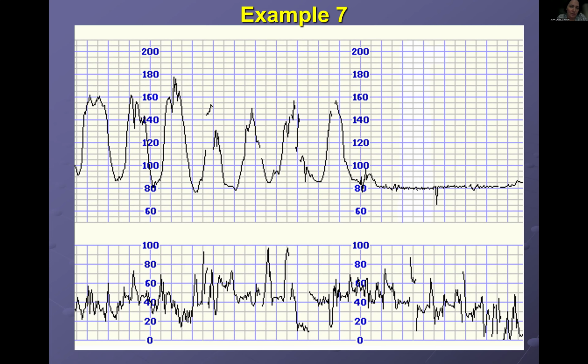This is the sort of thing that you would have needed to be called in for, and had the birth attendant interpreted the CTG properly, all this wouldn't have happened, because even at this stage they've already been with this bradycardia for 10 minutes. Already you're risking that even if you do the cesarean section immediately, the Apgar score is going to be very poor.